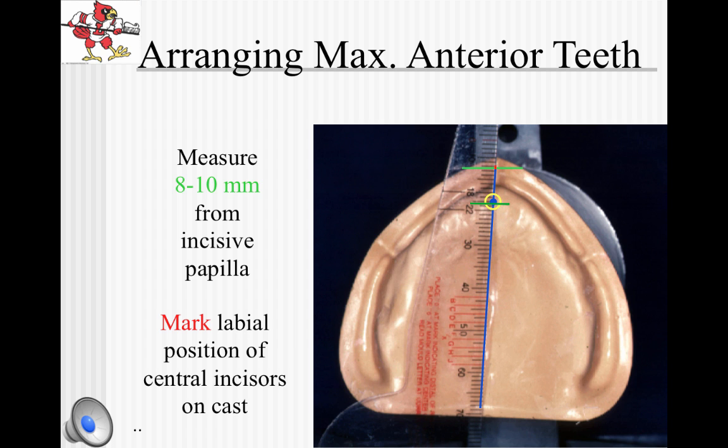The labial surface of the maxillary incisors will not be set beyond this green mark. The average distance from the middle of the incisive papilla to the labial surface of the maxillary incisors has been shown by study to be 8 to 10 millimeters.